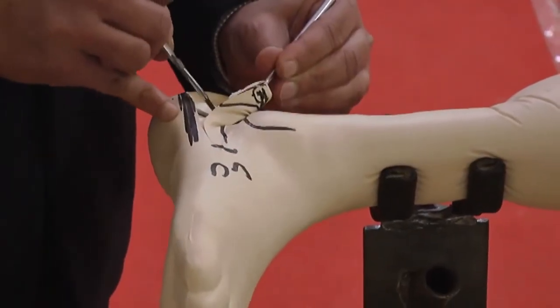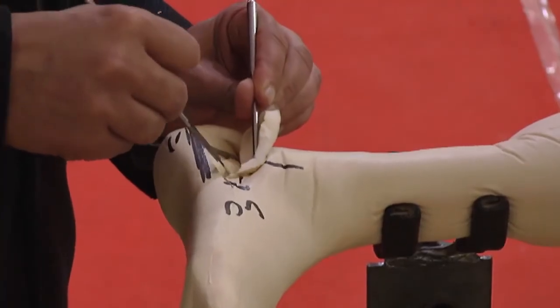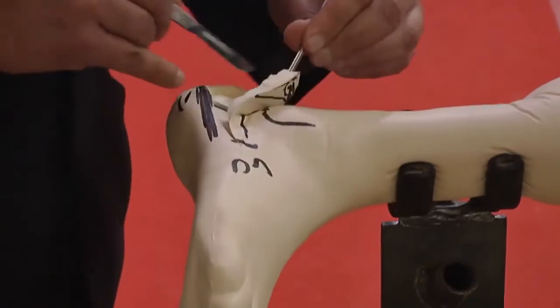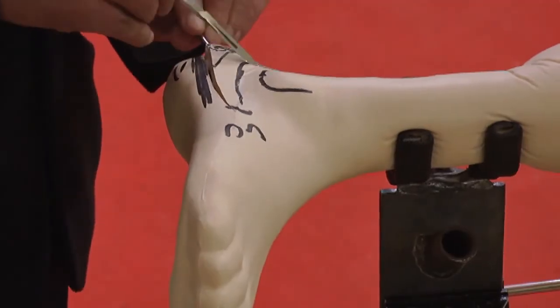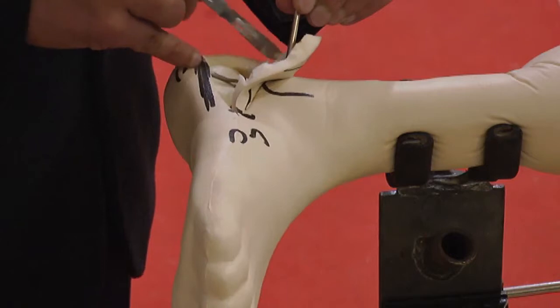So your knife goes and touches that area, and as far as possible subperiosteally, you lift off that flap from the bone. Now when you do that, the calcaneal artery will be in this flap, as well as the sural nerve, and you will not be cutting any of these structures.